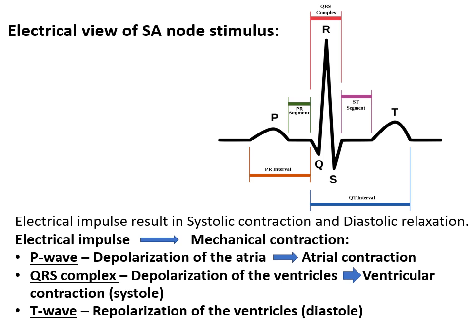So let's look just below here now. P wave is the depolarization of the atria, which then will lead to an atrial contraction of the muscle. A QRS is depolarization of the ventricles, which then leads to a ventricular contraction, and that's what we mentioned before is called systole. Ventricular contraction is systole, and that's going to come into play when we talk about blood pressure.